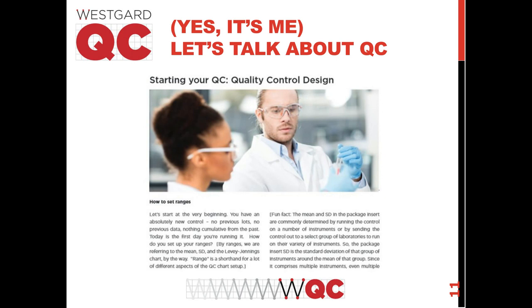Beyond the selection and the makeup of the controls, there are the QC rules themselves. And that, of course, is right in our wheelhouse at Westgard. We talk about QC.